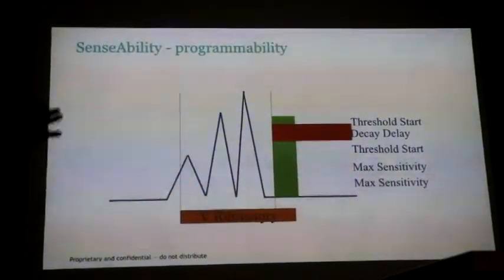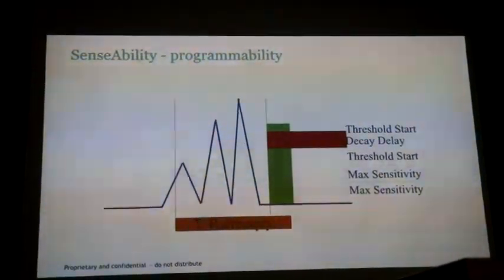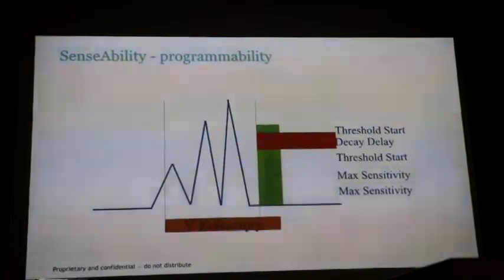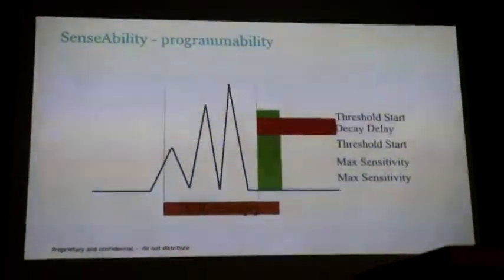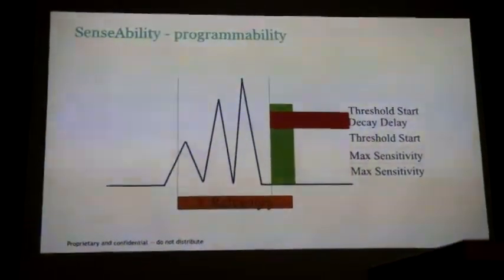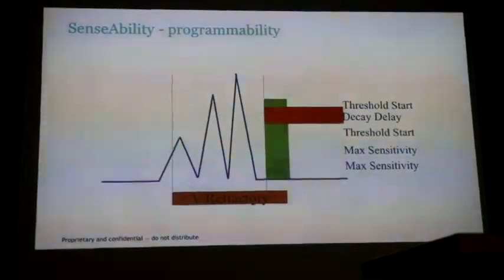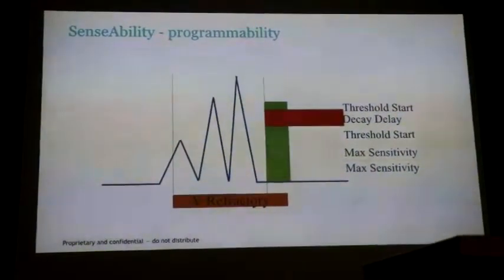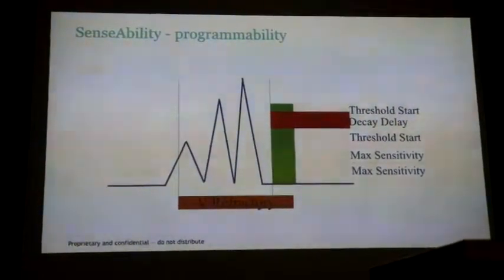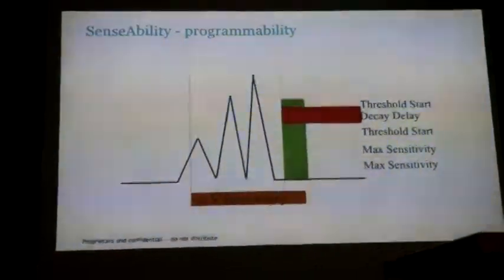So there's all this technology, all this stuff, and it's kind of like, well, which one do I use for which situation? So we'll walk through them. This one here, the only time you want to extend the ventricular refractory period is if you're double sensing the R wave. If it's an implant and you're sensing the R wave twice, you should probably move the lead. So you never make these changes at implant. We say to the doctor, please move the lead, get a better signal. Because if it's very wide, it's probably not a great signal. So we want a sharper signal.